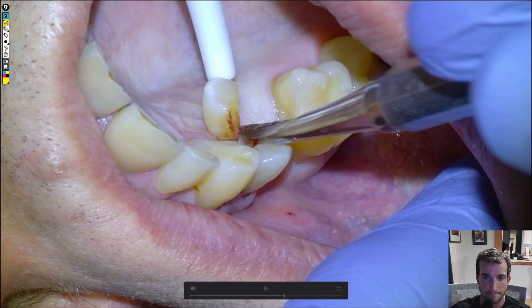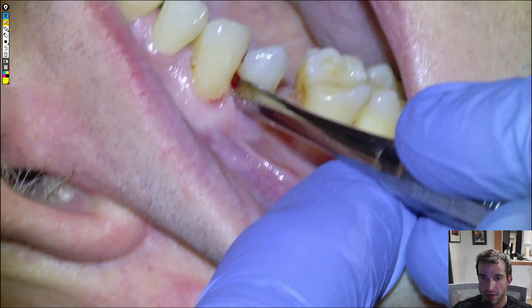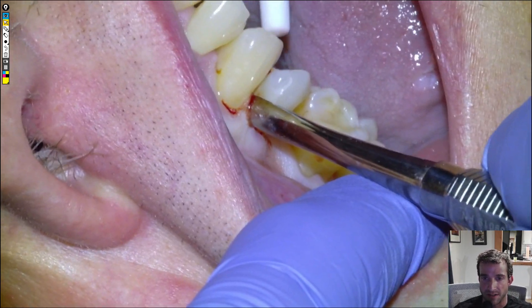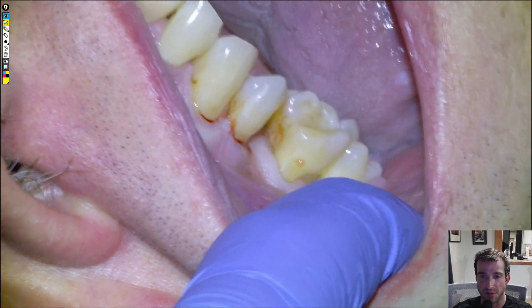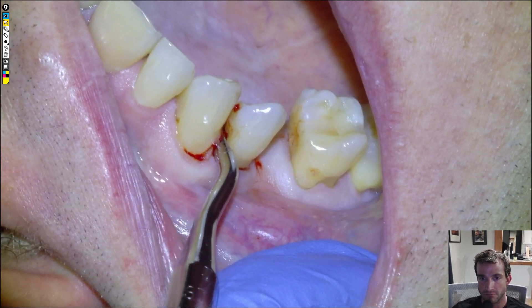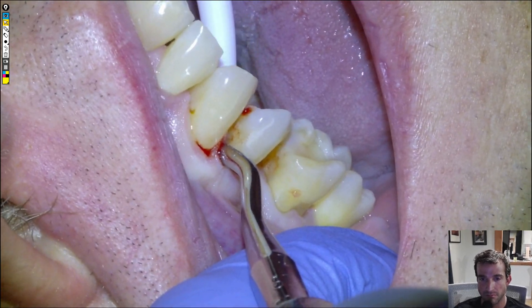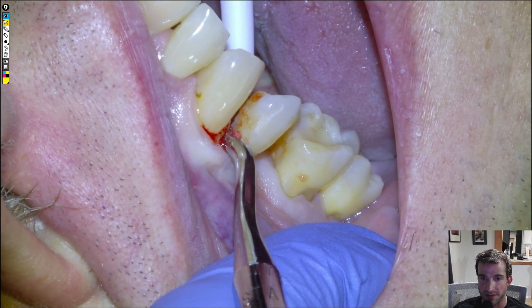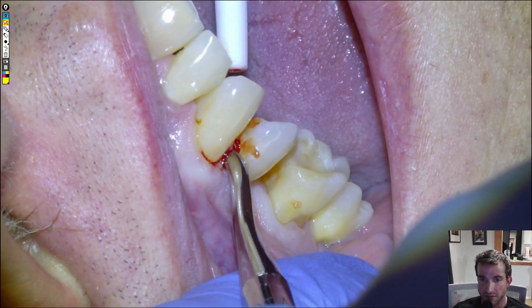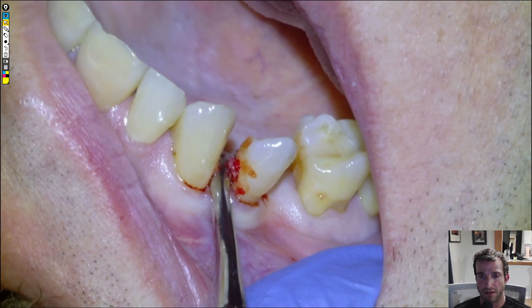The lingual root might sting because this is a four — these teeth have two roots — and there's a good chance the lingual root will break away as it gets elevated. So we're going to take our time. If I tried to grab it too quickly it could break off, but we get decent mobilization on it, enough that we are able to trust the forceps to grab it.